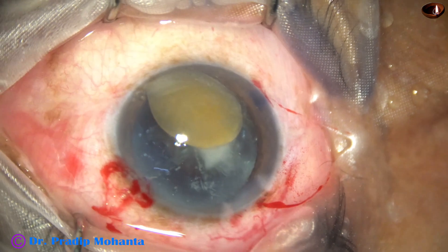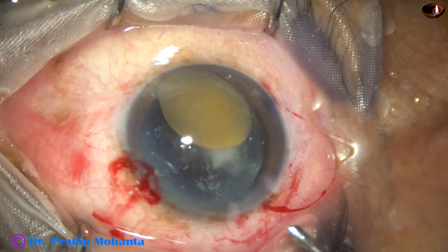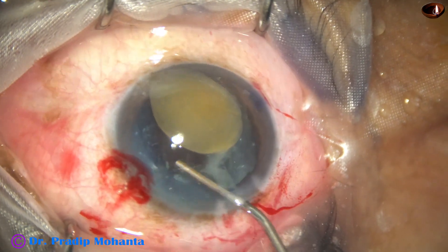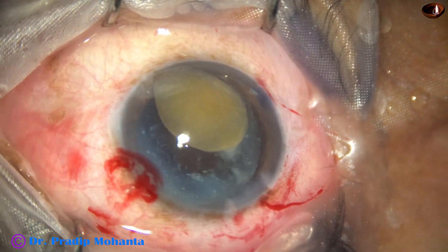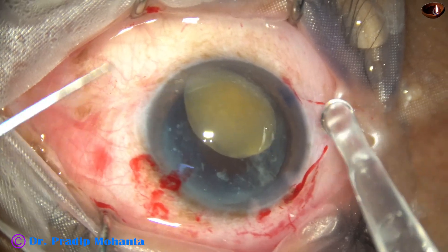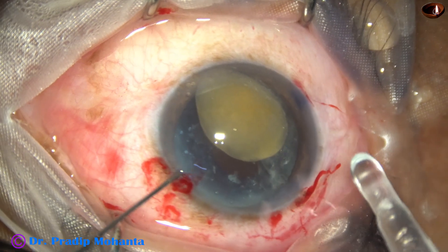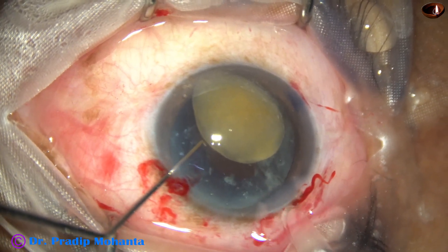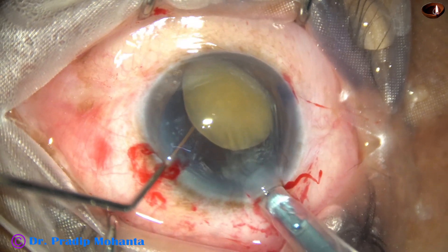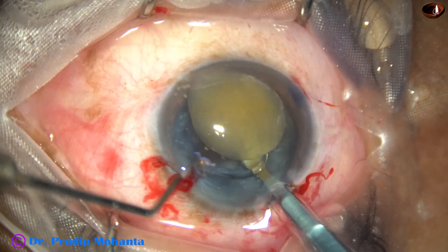And now I prolapse the small nucleus out of the capsular bag. My plan is to put an intraocular lens at this moment. Here goes a hydrophilic, acrylic, single-piece, monofocal intraocular lens in the capsular bag.